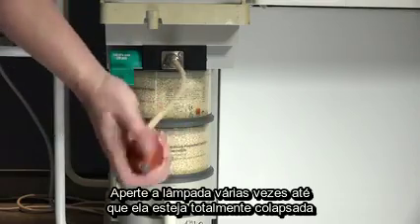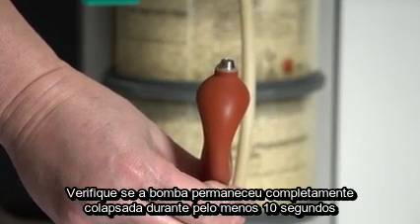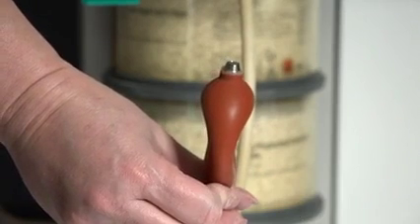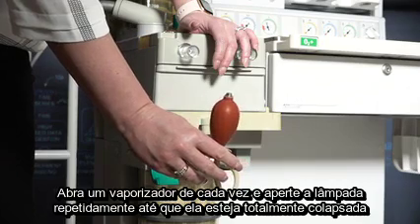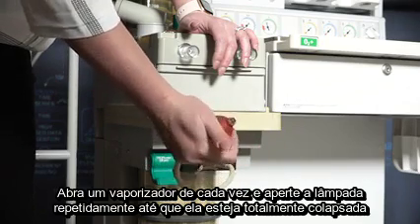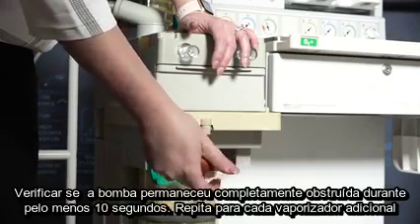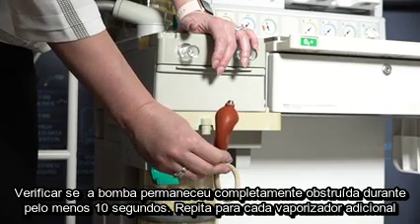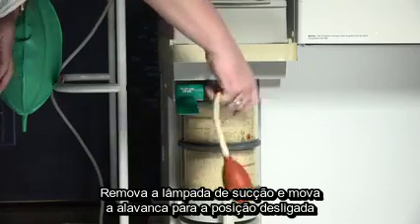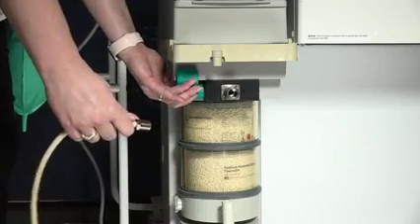Squeeze the bulb repeatedly until fully collapsed. Verify the bulb stays fully collapsed for at least 10 seconds. Open one vaporizer at a time and squeeze the bulb repeatedly until fully collapsed. Verify the bulb stays fully collapsed for at least 10 seconds. Repeat for every additional vaporizer. Remove the suction bulb and move the lever up to the off position.